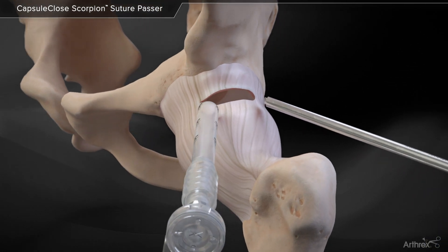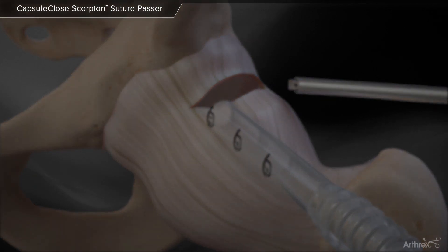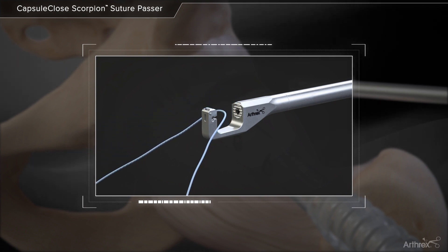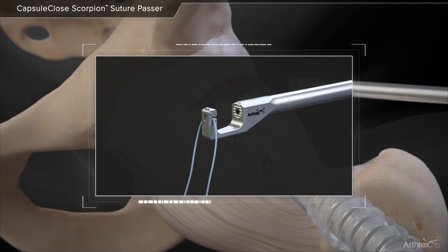The capsule-closed scorpion allows the surgeon to pass and retrieve suture while repairing the capsule following hip arthroscopy. Load a No. 2 fiber wire suture into the distal jaw of the capsule-closed scorpion by pulling a looped end into the small slot until it is fully engaged.